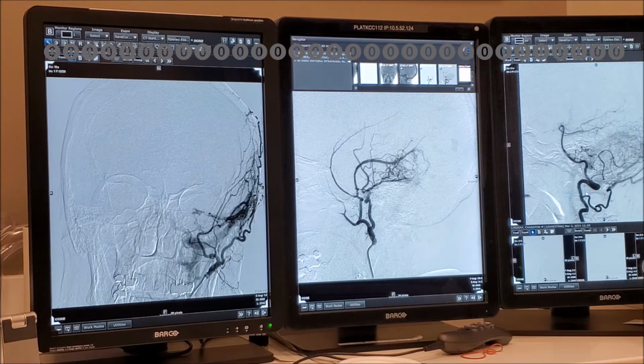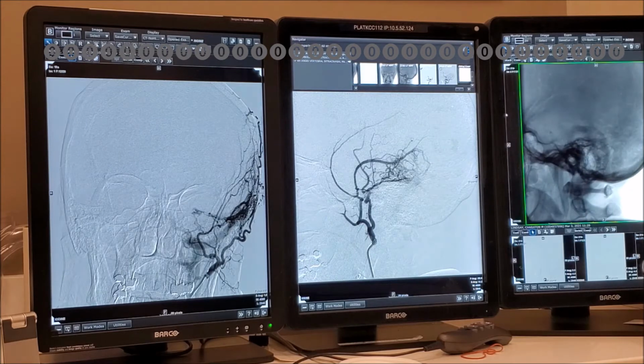Now you're going to look at every angiogram you do. You're going to be looking for these arteries, I hope. There's also an interesting PICA here. But anyways, let's finish with a dural malformation. I need to find, I'm missing a piece.